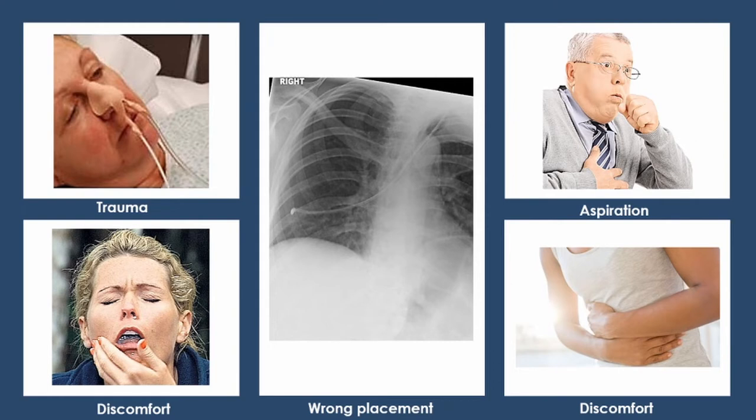What else? Wrong placement. Those are the risks. Unwanted scenarios such as wrong placement of an NG tube into the lungs will allow food and medicine to pass through it, and that can be fatal to the patient.